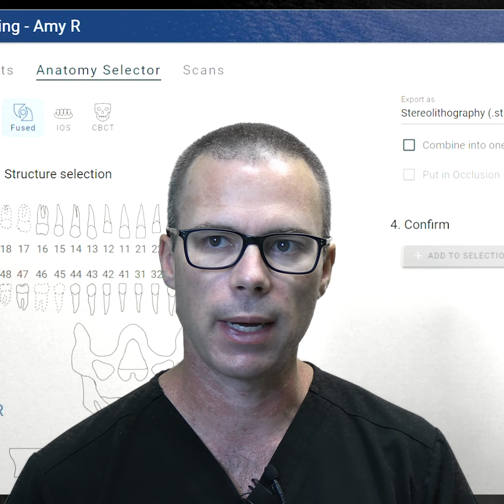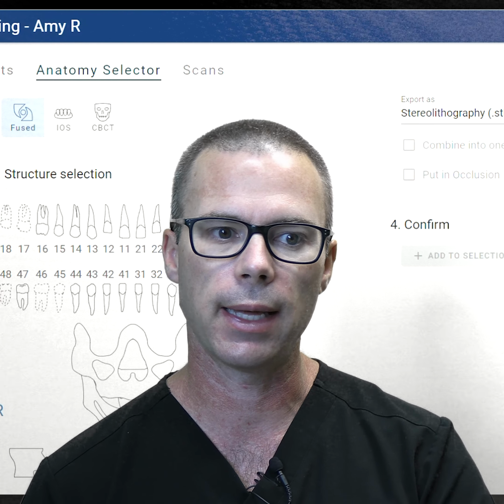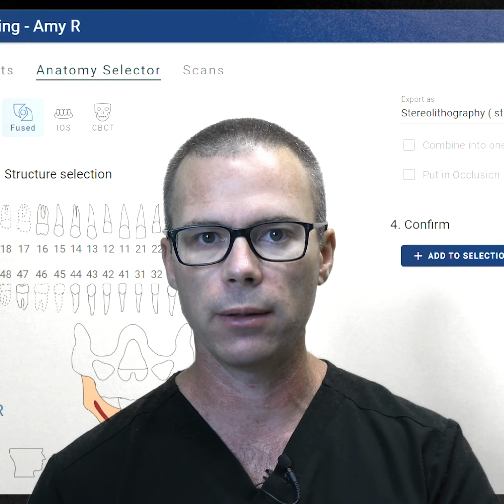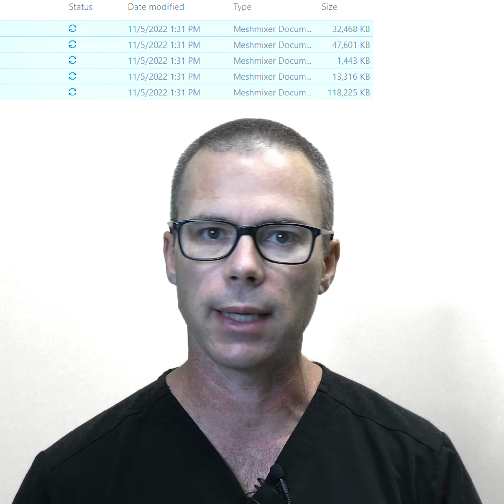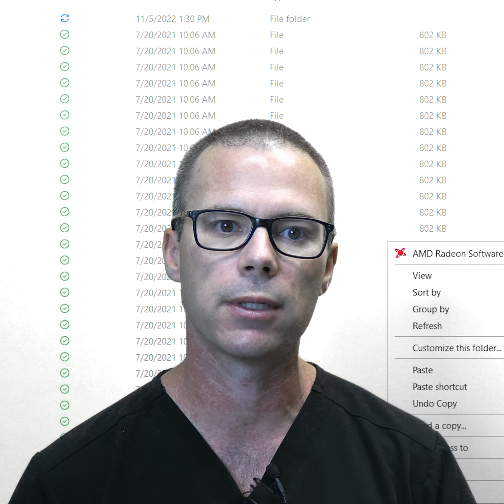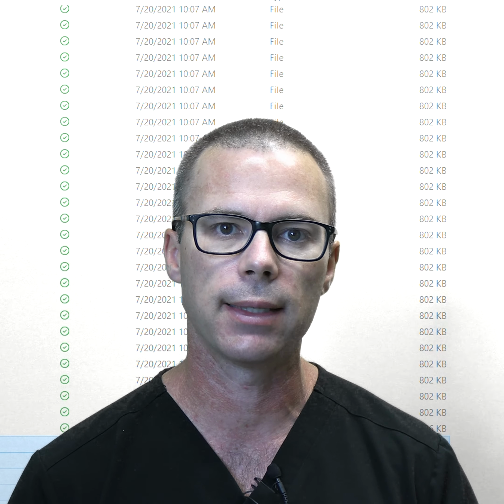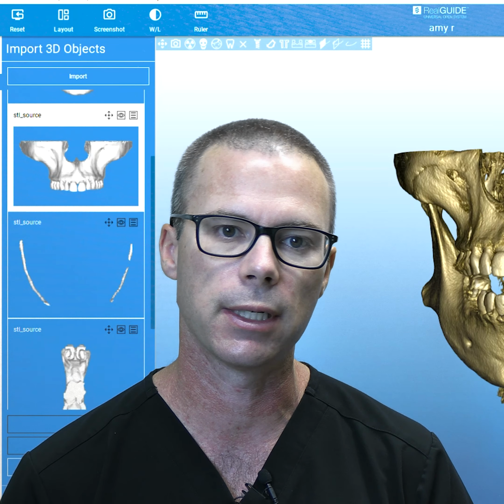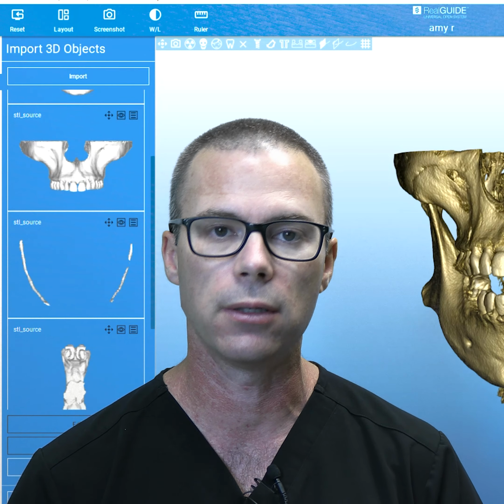So I actually found this by accident. To be honest with you, I'm not that smart. I had uploaded my CBCT folder, which also had my Relu segmented structures in it, into a dental implant treatment planning software that we use. What surprised me was that the software recognized those STL scans and imported them automatically into the correct position. So again, this was a time saver that I wasn't even expecting the software to do for me.